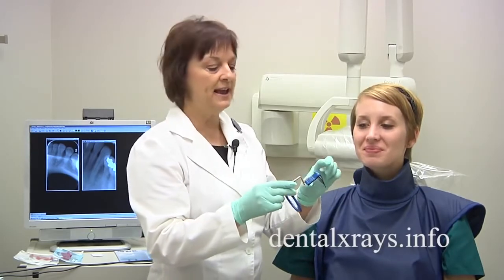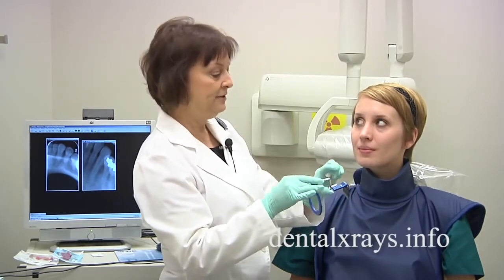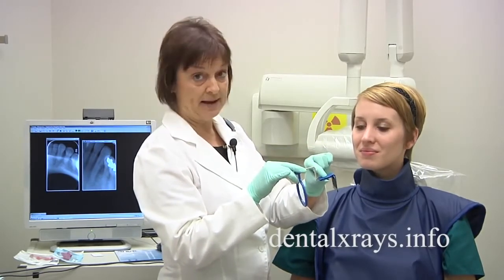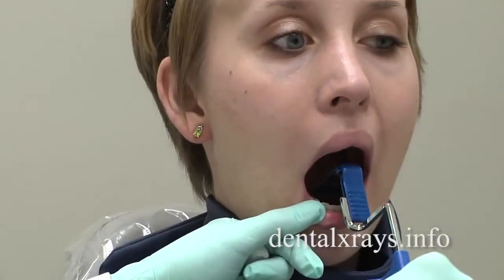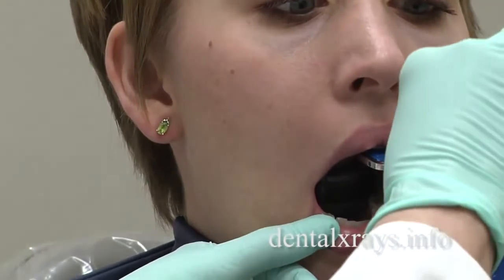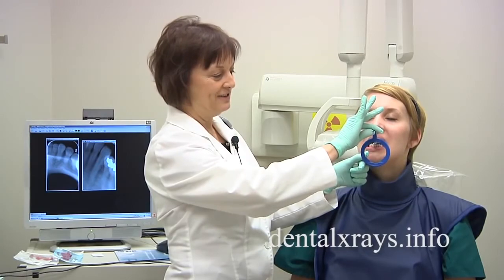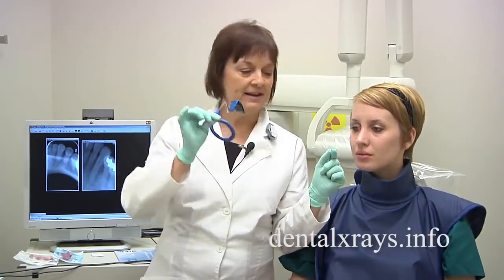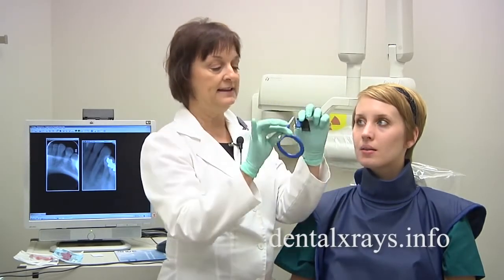A good idea is to actually explain to the patient what you want them to do before you put it in. So I would say to her: my goal for you is to gently bite on this, and then they know what to expect. Another error people make is when they place it here, they slide it up and hold it up, so when the patient tries to close it's difficult. It's jabbing down below and you're not allowing it to actually find its way. So let go of the bar as she's closing and it'll kind of ease into place.